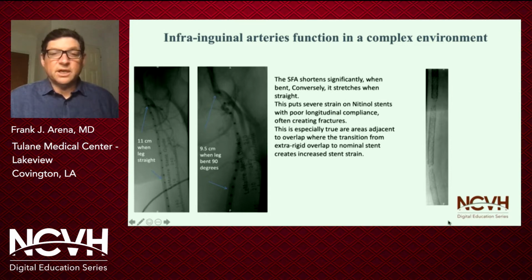We often see nitinol stents fracture in areas adjacent to overlap, where the forces of the bending and motion occur on the area of the stent that is not extra rigid, as would be in the overlap. In the more nominal portions, often that is more than the stent can tolerate and creates significant compression, as in the picture on the right.